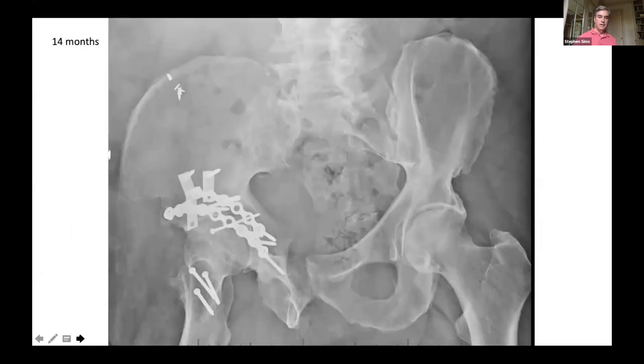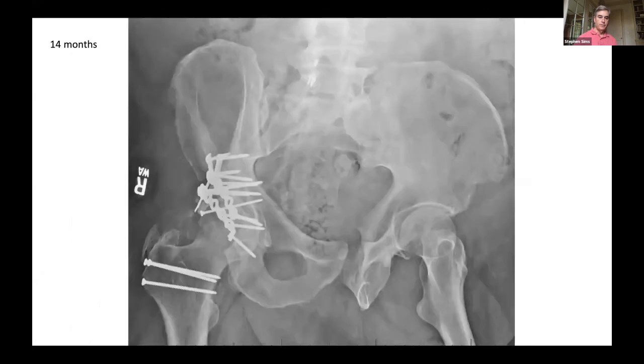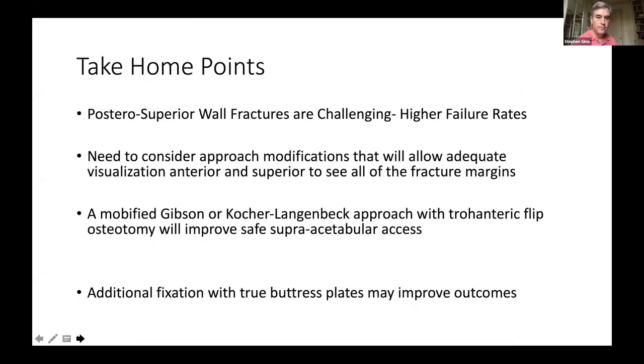You can see the iliac oblique view and the obturator oblique view as well. So I have about four and a half year follow-up on him clinically. On the last office visit, he goes to see his primary care doctor because of all his multiple medical problems. He sees a cardiologist regularly as well. He's actually got good function. He walks with no assistive devices. He takes an anti-inflammatory occasionally, but that's for a rotator cuff tear that he has, not for his hip, and has not had to have a hip replacement in that 4 to 5 year interval from a clinical standpoint.